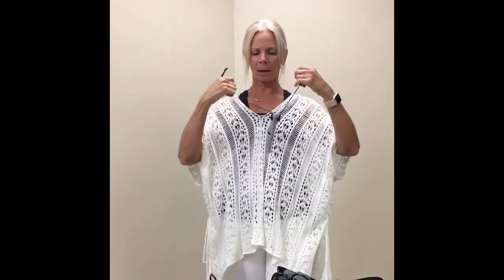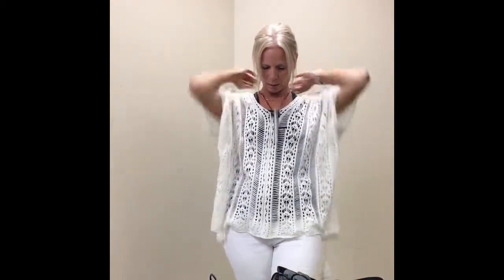Okay, so now the microphone, when it is connected, you'll put your microphone on and you'll wear it like this. It does not need to be adjusted at all. This microphone gets great reception. The main thing that you'll want to know is how to mute the microphone.